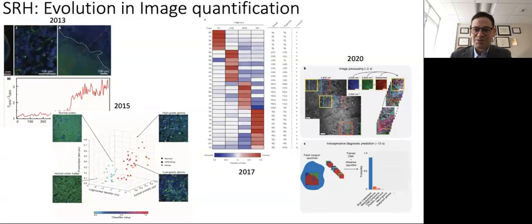So the images this system creates are natively digital, and starting with the earliest days of the project, we worked to quantify them. When I was her fellow, I went to Dr. Golby with some images from the early system we were using that I was excited about. She essentially said, these are pretty pictures, but you need to figure out a way to quantify them. The editors at Science Translational Medicine said the same thing. And our first foray into SRS data analysis was born.